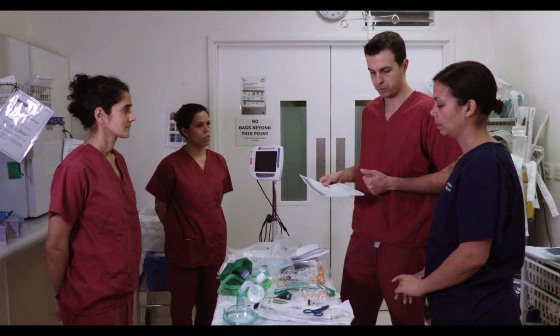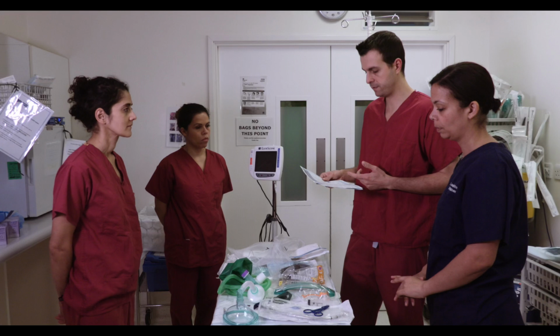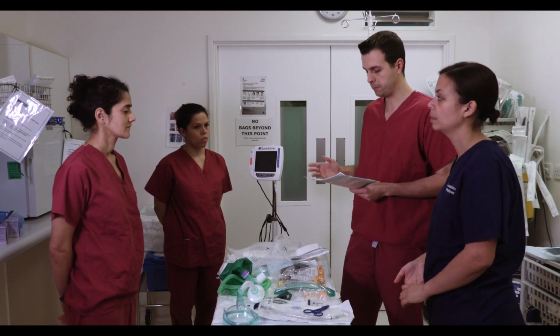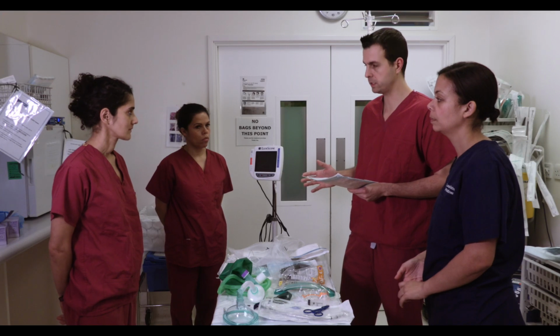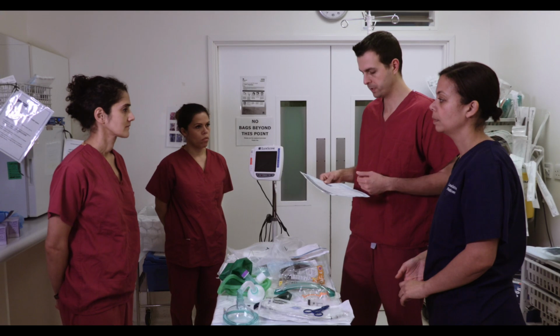Plan B will be supraglottic airway, which we have here. Plan C will be 2-person face mask ventilation with adjuncts, which we have laid out. Plan D will be emergency front of neck access for difficult intubation. I will be doing the front of neck access if we need to.